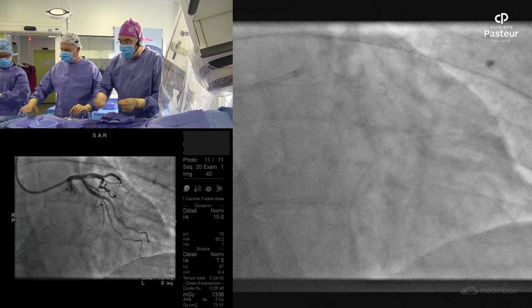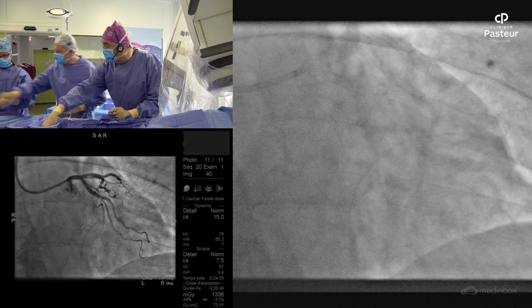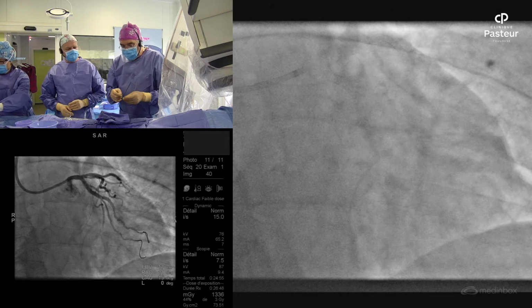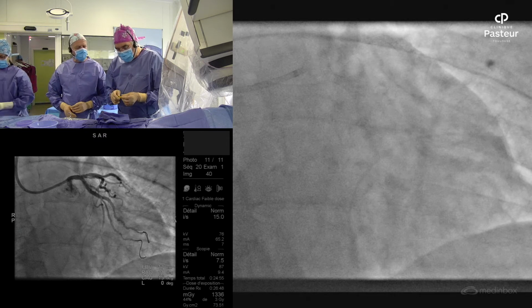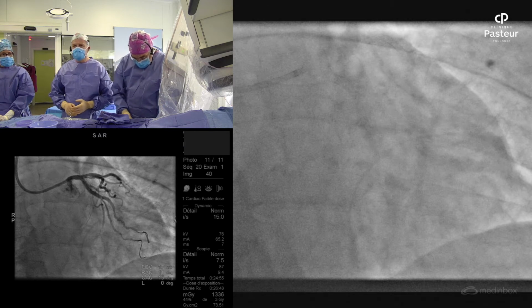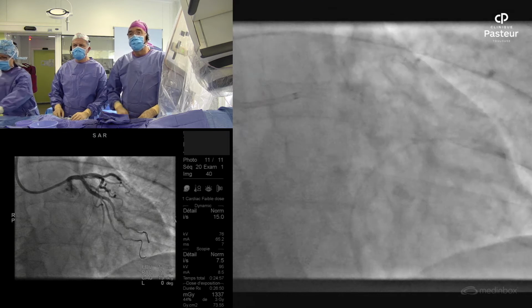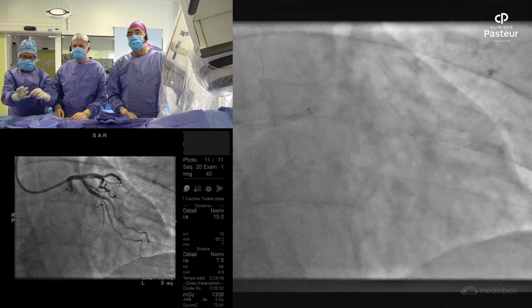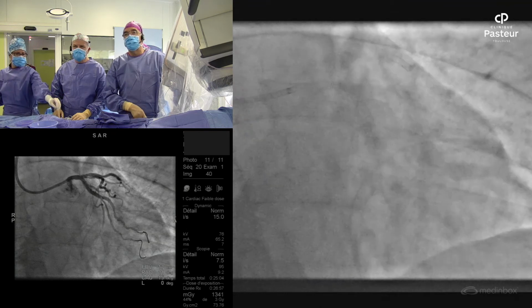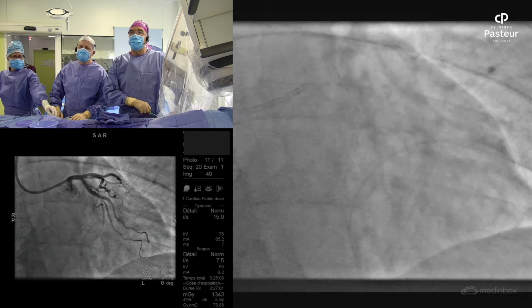And I said it's the problem of the needle. It's a problem of the twisting of the wire and the non-compliant balloon also. And then when you move, the resistance, the friction with the non-compliant balloon. So I will advance a little bit the guiding, and the guiding now is not in. You see all the difficulties.